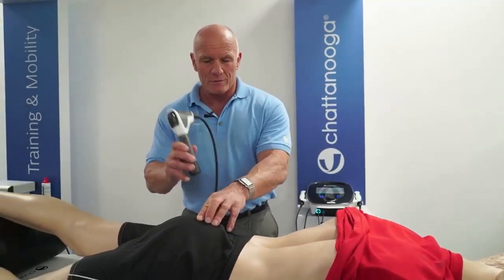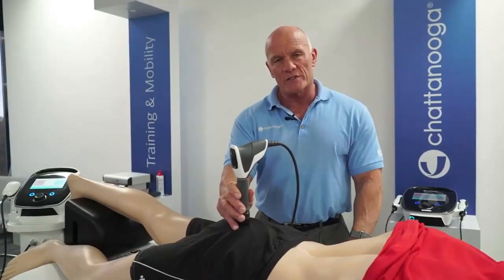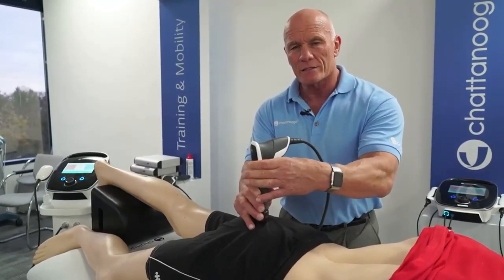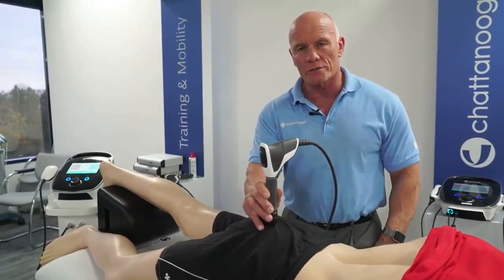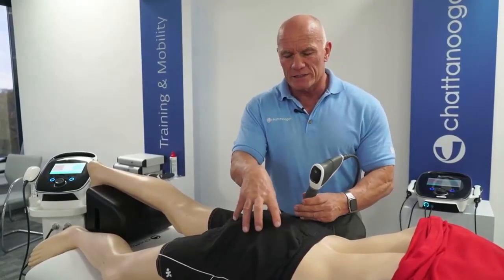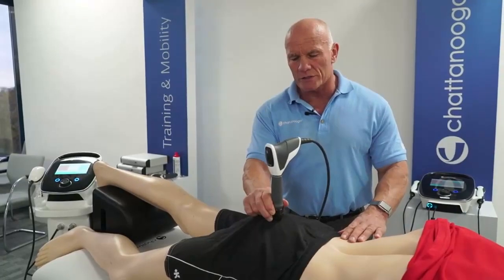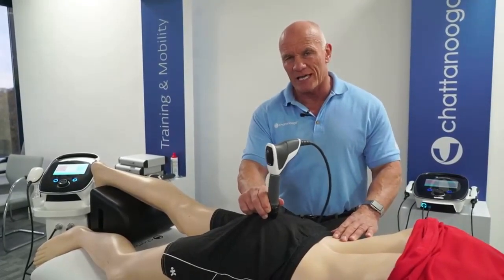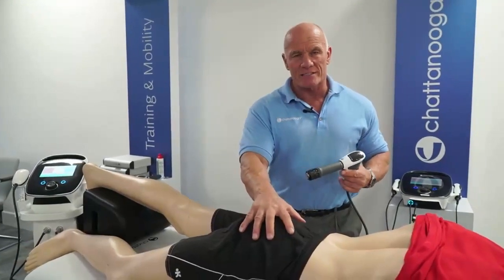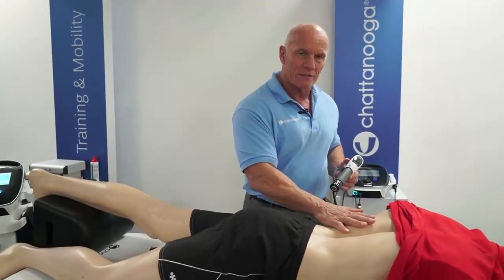And again, I might set it at 2,000 shocks, continue over the same area, but probably I will pause at 1,000 shocks and then retest it. Now, one thing to consider is never give more than 6,000 shocks over one specific area. Okay? So, having addressed the myofascial trigger point here, we now need to look at this bound down fascia.